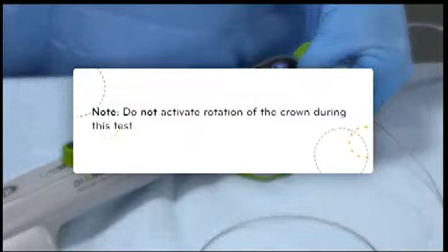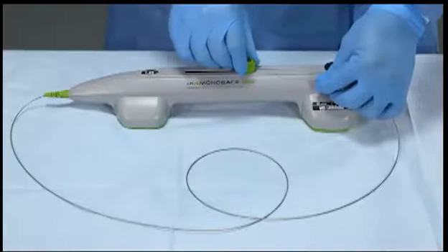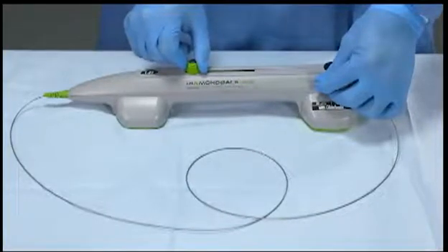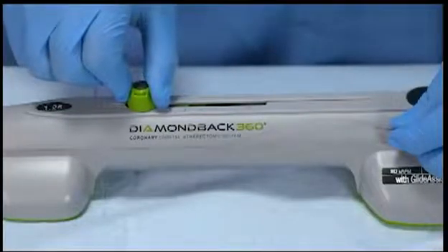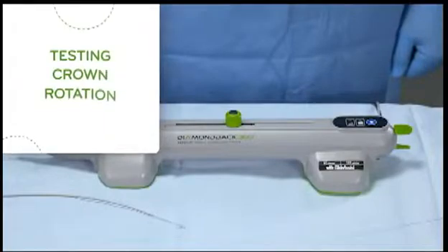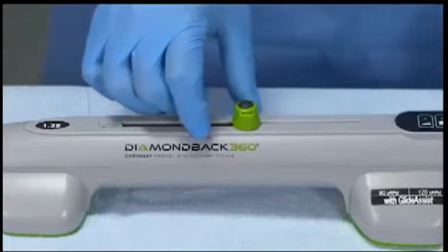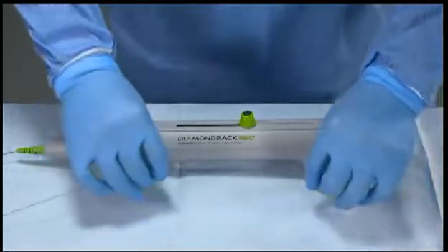Do not activate rotation of the crown during this test. Ensure that the crown advancer knob is in the unlocked position, allowing free axial travel. While visually monitoring the crown, slowly move the crown advancer knob in a back-and-forth motion. After testing the crown advancement, test the crown rotation. Move the crown advancer knob fully proximal, away from the nose of the handle, and release the guide wire brake before threading the guide wire through the shaft.